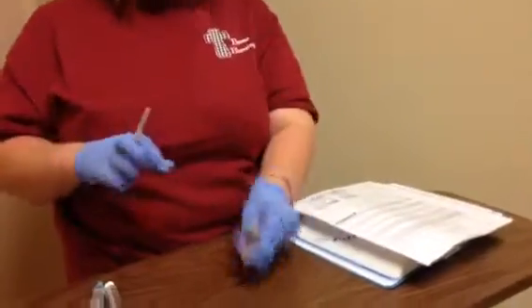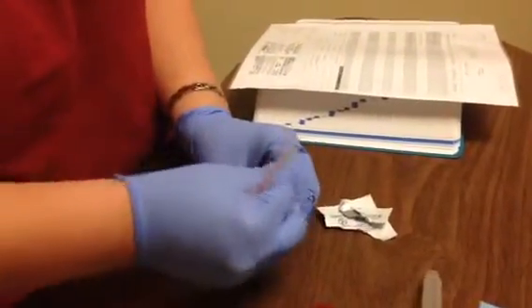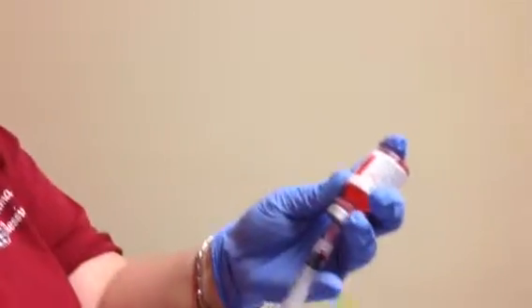Usually these pain meds are going to be a one-time use vial, so more than likely you're just going to pop the top off. But just in case, you can always clean it with the alcohol. Okay. So I'm going to be giving 1 milliliter of medicine. So I'm going to draw up 1 ml of air. Take my cap off. Insert my air. And now I'm going to draw up my medicine.